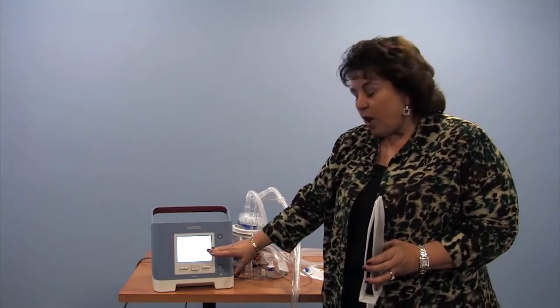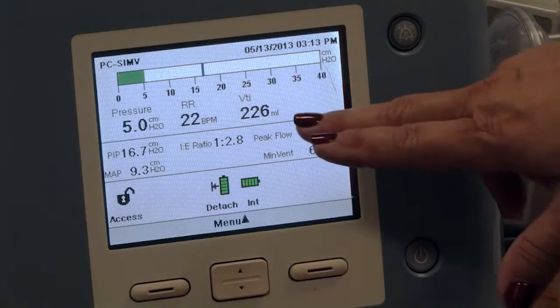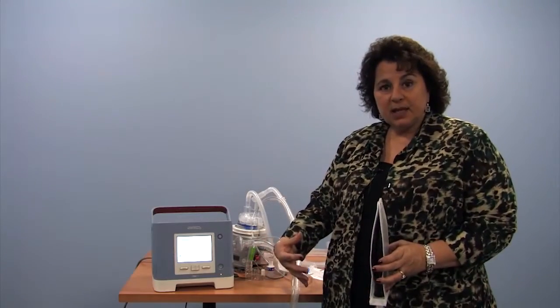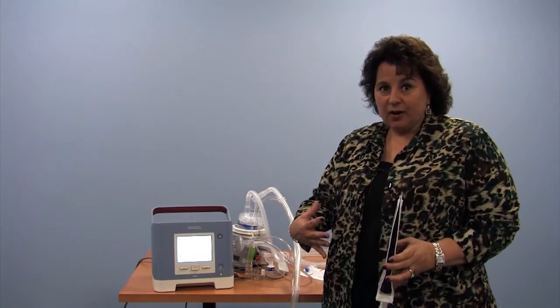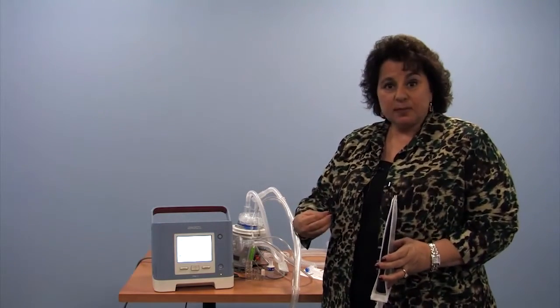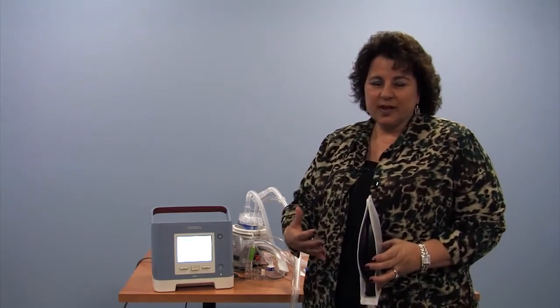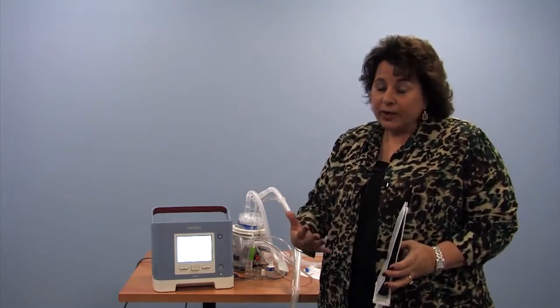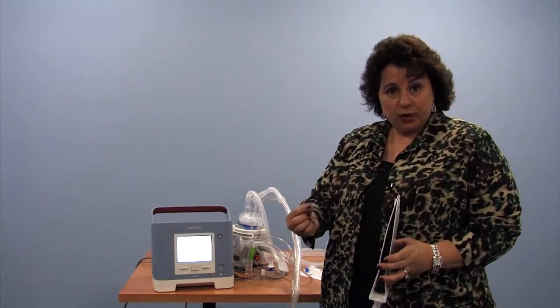Other numbers that you can watch when your child's on a pressure type of ventilation, as we have here, is the size of the breath. If the tidal volume and the minute ventilation seems to be going down, it may mean that secretions are building up and they're receiving less air per breath because mucus is building up and they might need to be suctioned. There are obviously many ways in which you can tell if your child needs to be suctioned: by putting your hand on their chest, by hearing a cough, by noticing perhaps a saturation change if you're looking at the saturation at that time.